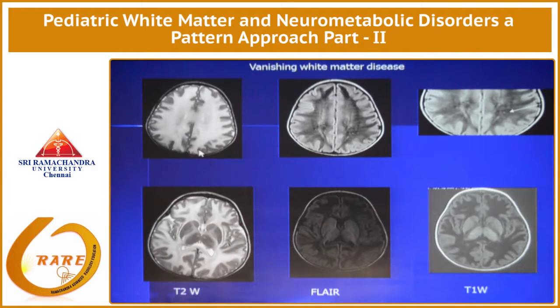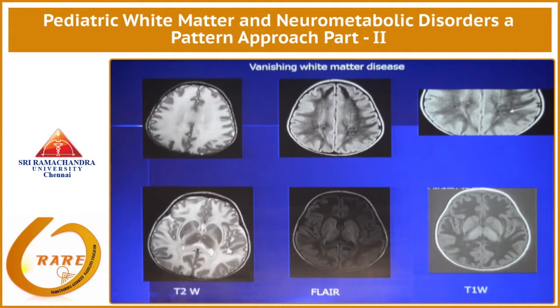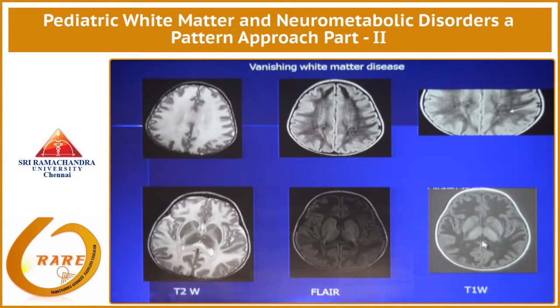She has a diffuse white matter abnormality. Remember, diffuse white matter involvement can be seen in Canavans, vanishing white matter, and MLC. But look at the FLAIR — it becomes very hypointense. This is really rarefied white matter, and you can see small spotty areas where the white matter has been spared. On T1, it shows intensely low signal — this is very typical of vanishing white matter.